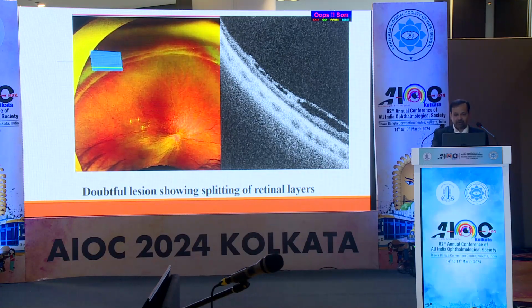My last 1 or 2 slides. This is a very interesting patient. This, you can say, microcystoid kind of degeneration which was there. Once we did the OCT, we found that there was schisis in the area of ora serrata, and nothing was done to this particular patient.